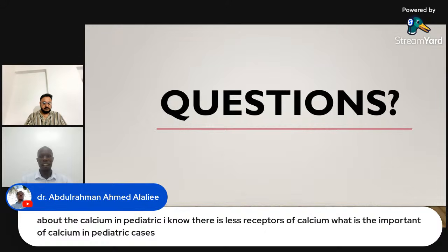The other place we use calcium is when you are doing the blood prime. Remember, the blood stored in the blood bank doesn't have calcium. The blood bank uses a component called sodium citrate, and this sodium citrate binds calcium. Remember, calcium is clotting factor 4. So this blood doesn't have calcium, and we need calcium in it.